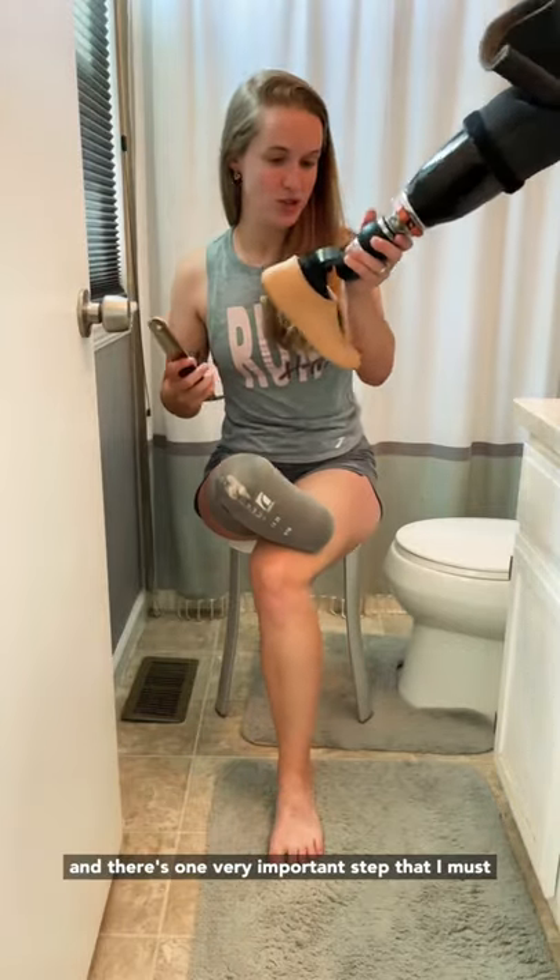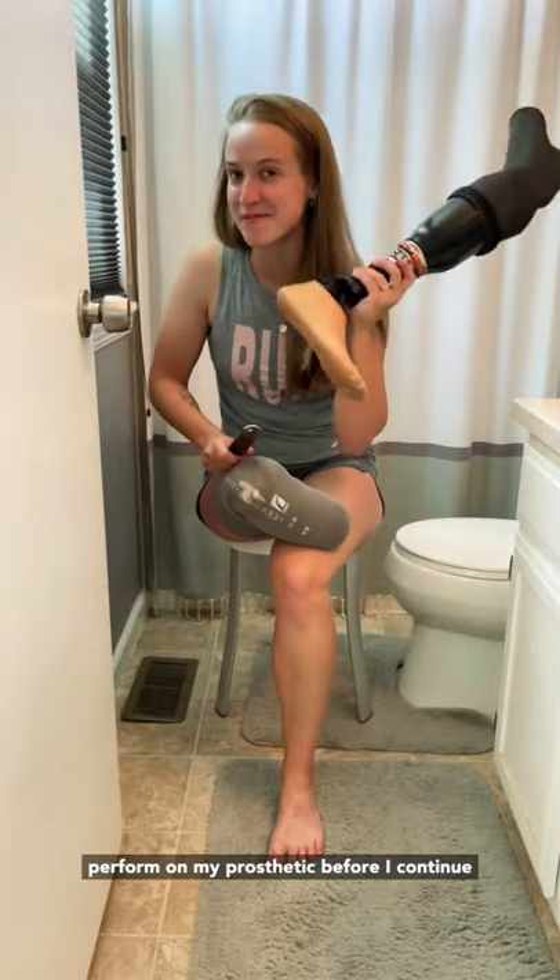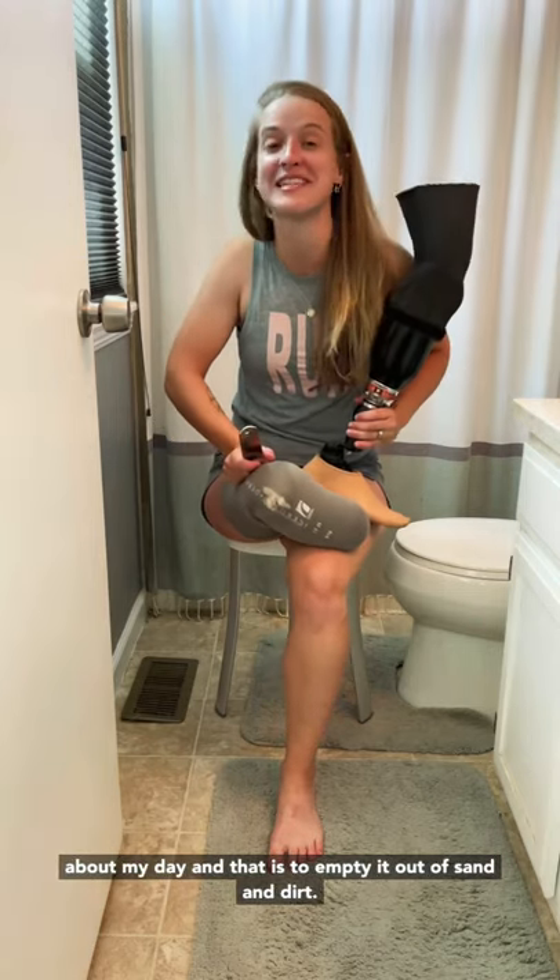So I just got back from a vacation to the beach, and there's one very important step that I must perform on my prosthetic before I continue about my day — and that is to empty it out of sand and dirt.